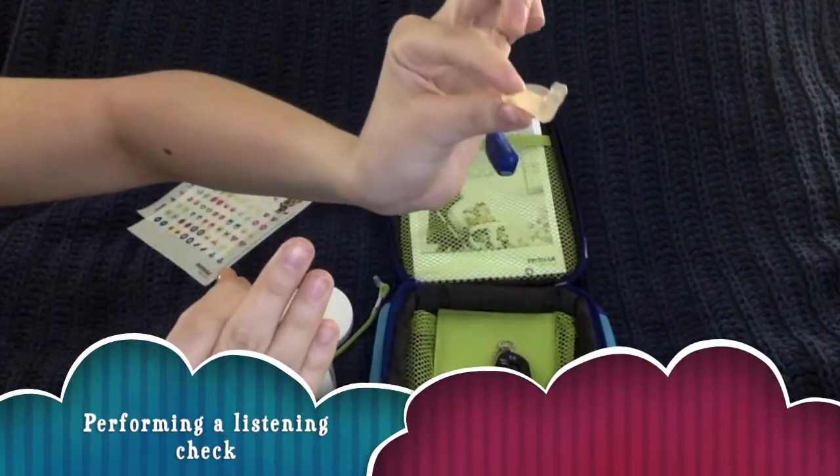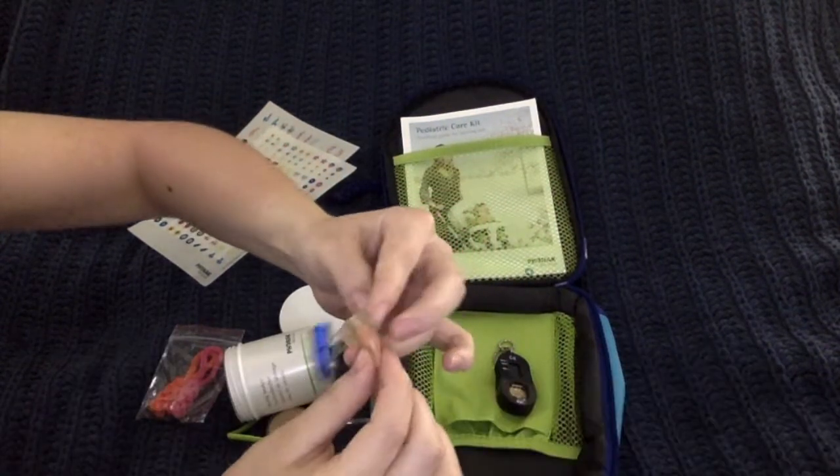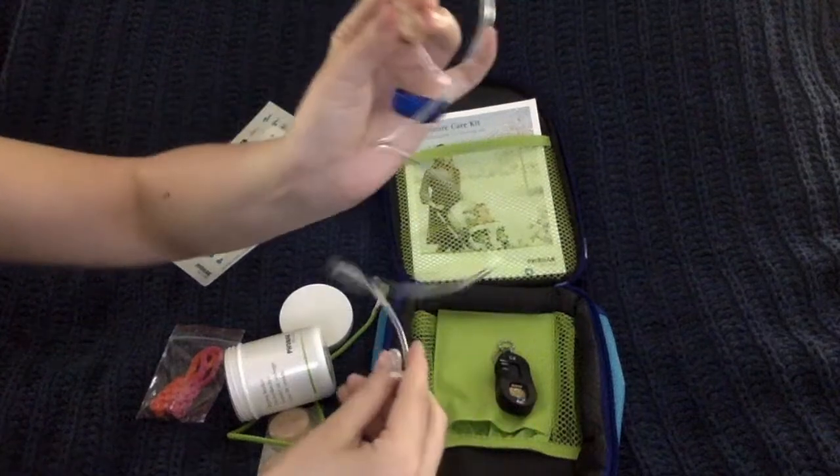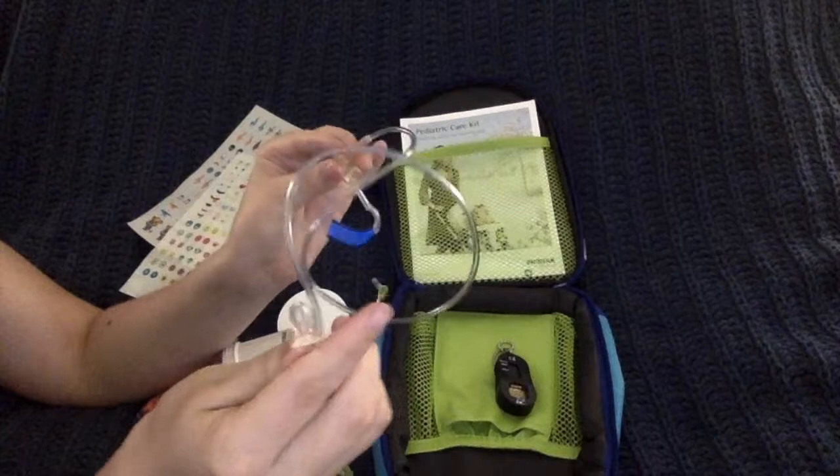To perform a listening check, place this tan cone onto the ear mold. Ooh, you can hear some feedback. This tube goes into your ear to see if there's any sound coming out.